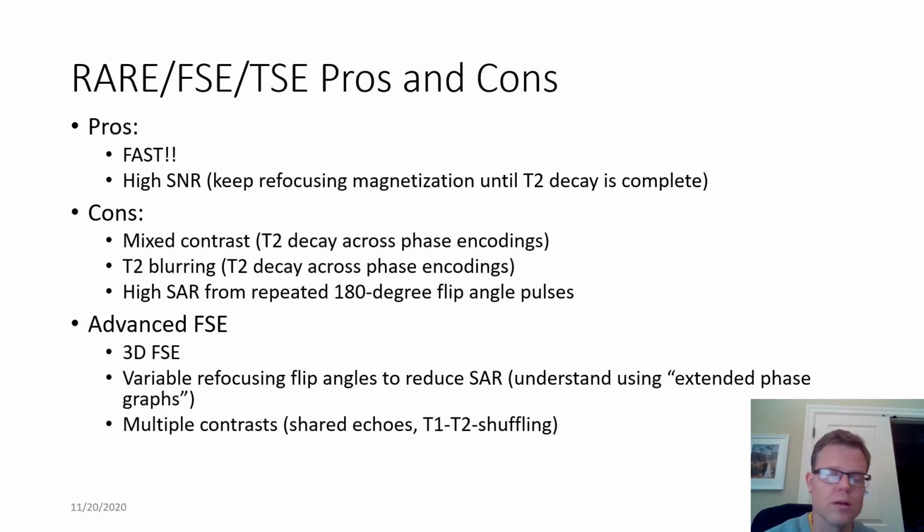And again, it's rare to do, no pun intended, a single spin echo sequence. I mean, with the exception of probably diffusion weighted imaging, but any T2 weighted imaging is probably almost all being done with a fast spin echo or a turbo spin echo sequence now.